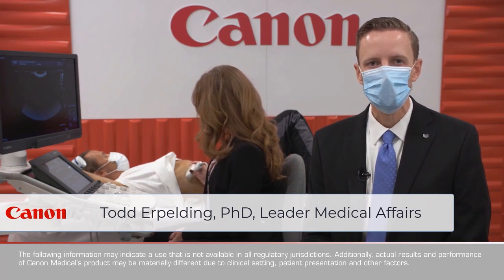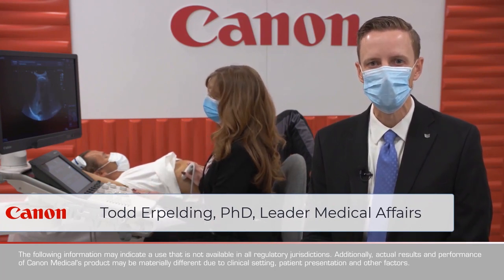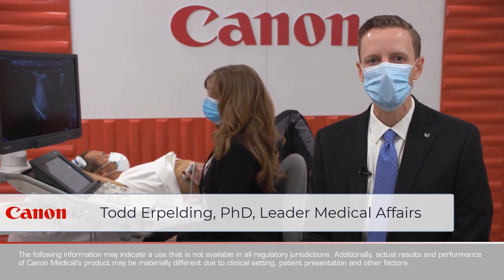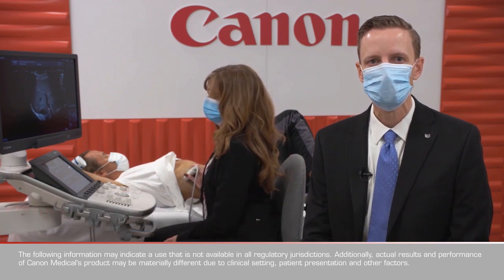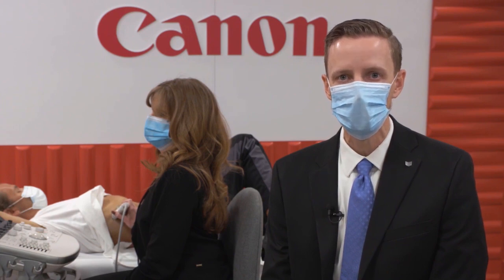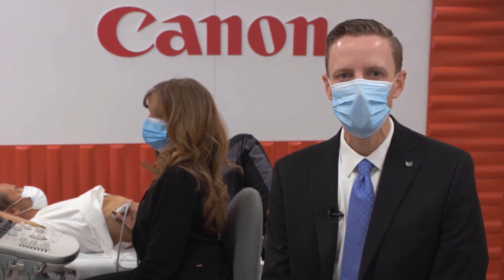Hello and welcome. I'm Todd Erpelding, Medical Affairs Leader at Canon Medical, and I'm here today with my colleague Tammy Logan. We're going to show you the liver analysis package on the Canon Aplio i800, our ultra-premium ultrasound system with outstanding workflow, ergonomics, and innovative imaging technologies.